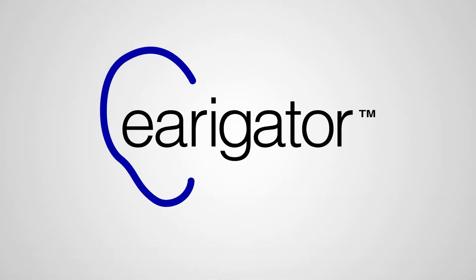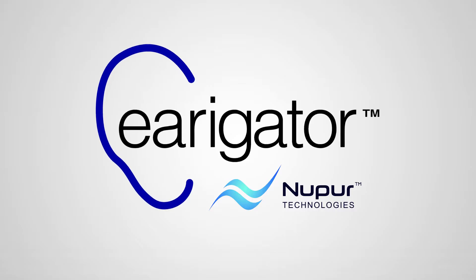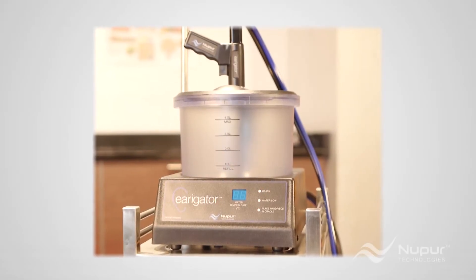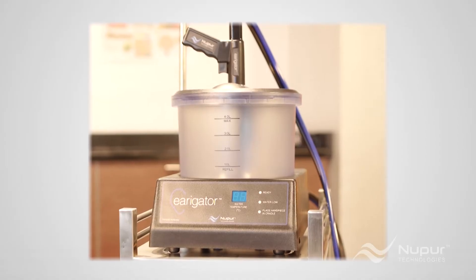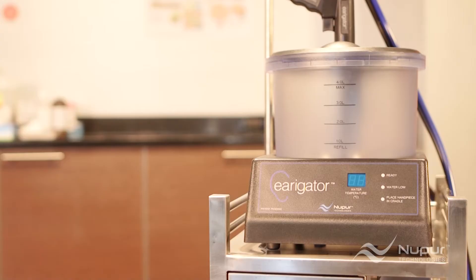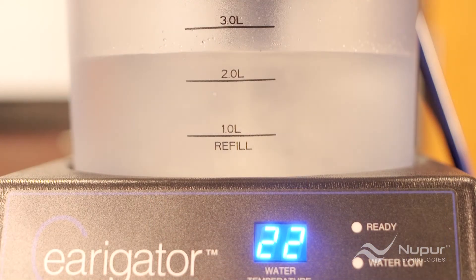Hello, and welcome to this brief user video on how to use the Earigator from Nupur Technologies to remove earwax. Earigator users have selected the fastest, most effective, and safe method to remove even stubborn earwax.